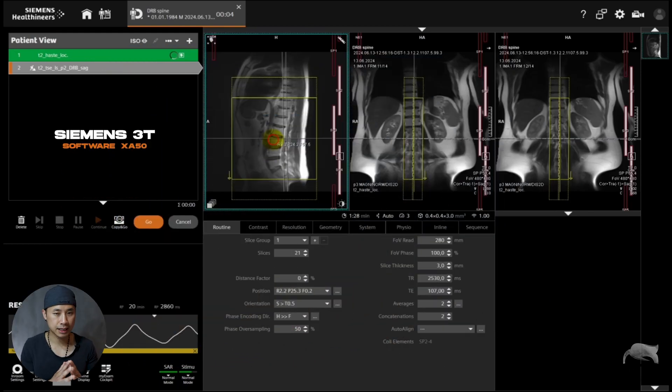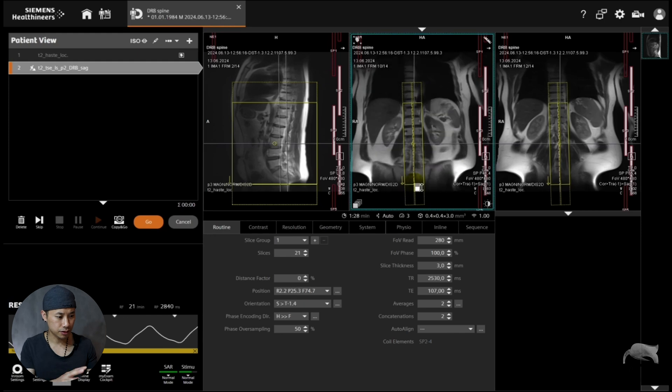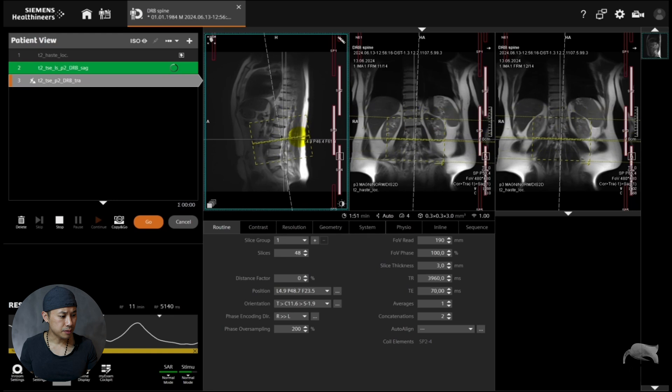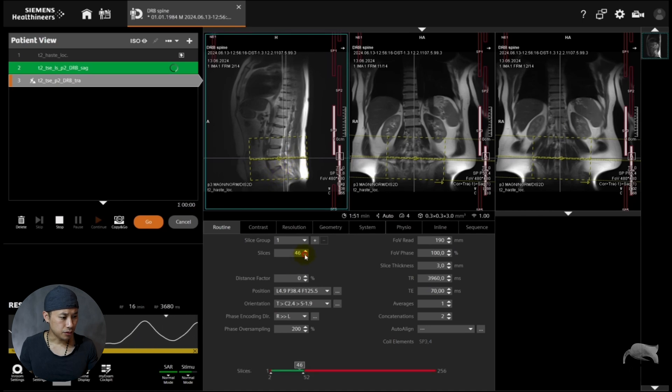Let's go to the scan and I will show you. We are at 3T — it's actually an XA50 software. We're going to do a spine. I'm just going to give an overview of the spine, do a T2-weighted sagittal and some positioning so we have a nice image to show you. What I'm about to show you is that some people use one block, like I'm using here, while others divide into multiple stacks for the transversal part. We're going to go for the transversal part today using a big block like I'm showing here.